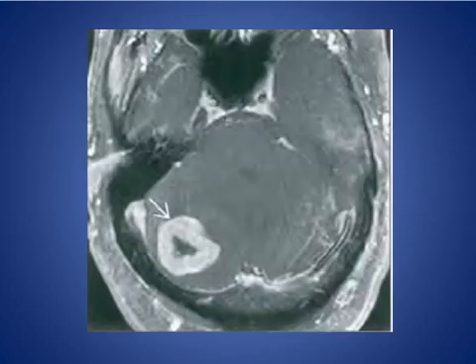As we see here in this axial contrast T1 fat-sat MRI: a solitary thick-walled enhancing mass lesion in the right cerebellum, biopsy-proven to be metastasis from melanoma.